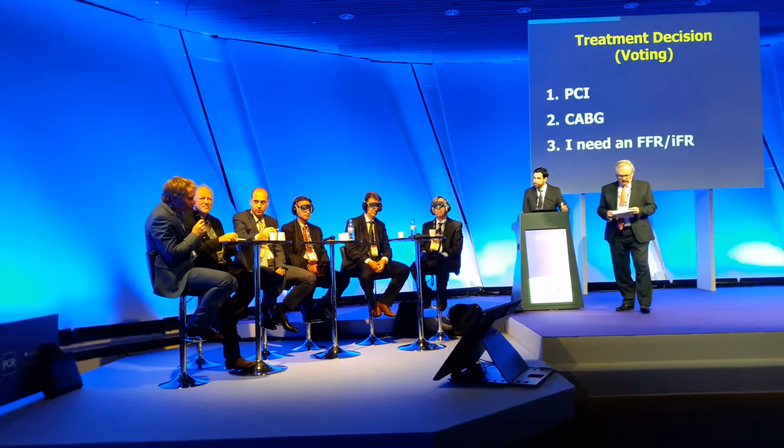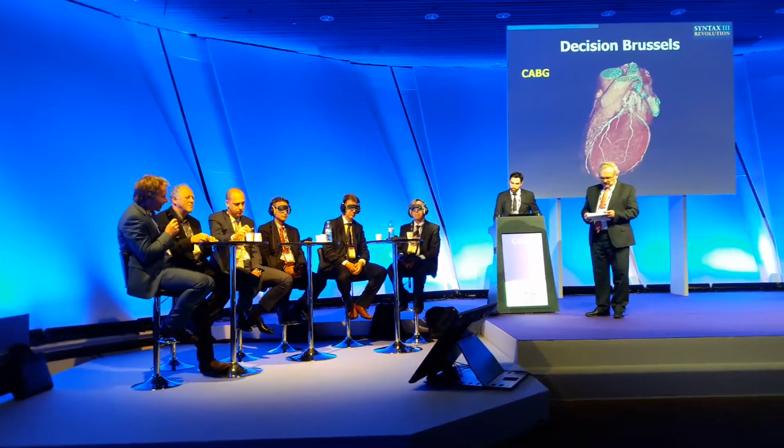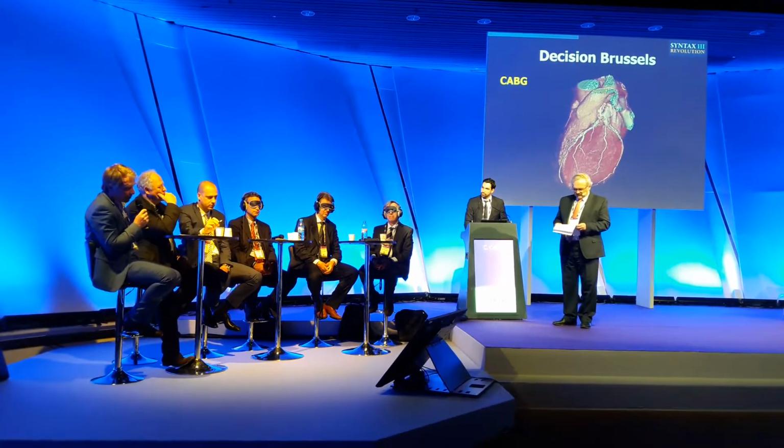So regarding all the information available, the angio, we would decide for a CABG, regardless of the interventional cardiologist in the room, and we would go for the LAD, of course, with the mammary, and then a bypass on the OM.